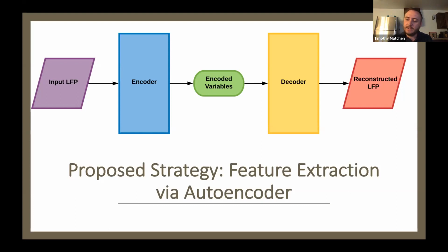And so what we wanted to do instead was to give a likelihood that a given burst was going to occur or not in the next time window. So a probability of that burst occurring, between a likelihood of 0 and a likelihood of 1. And again, based on both the current state of the power spectral density, as well as whether or not we turn on or off stimulation in the next time step.